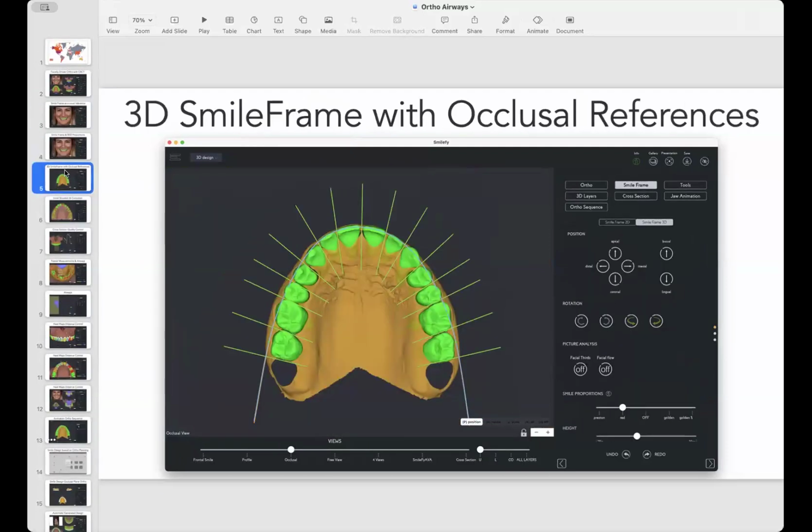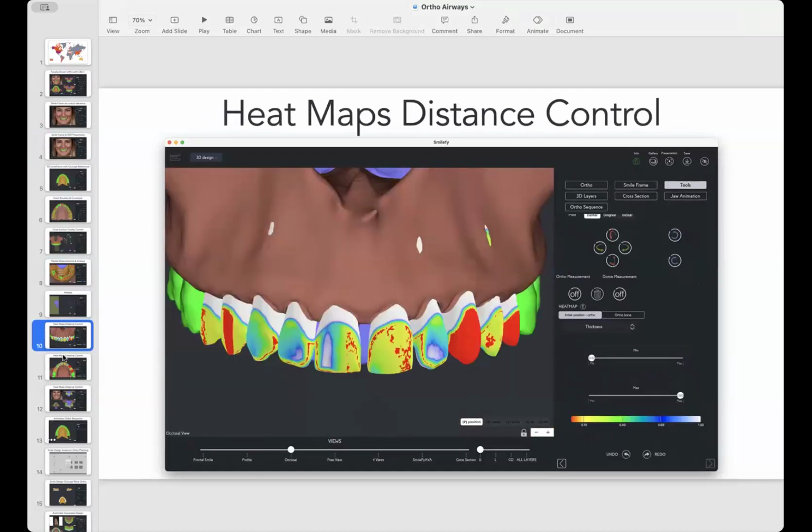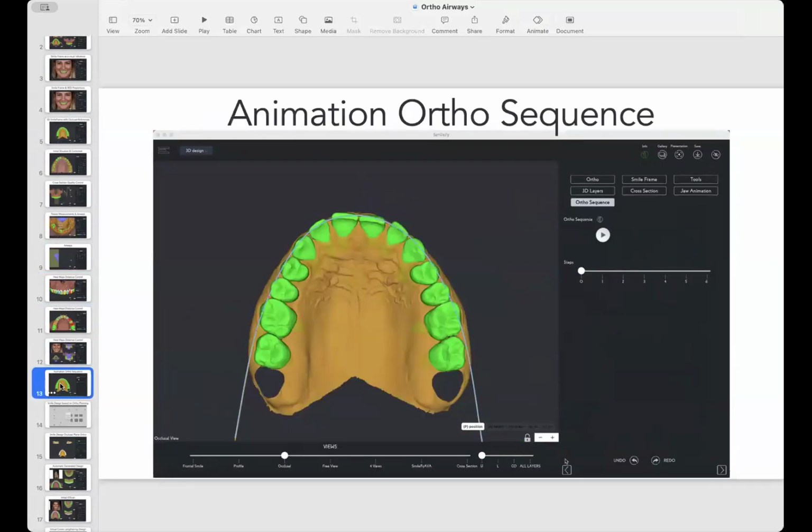It's a lot automated. It's going to be more automated, but it's important to have in one workflow, in one app, everything. I want to have the simulation. I want to have the motivational mock-up, the ideal design. I want to have the ortho planning. I want to have the airways. Everything is connected. So I cannot plan properly when I need 5 softwares for one treatment plan.